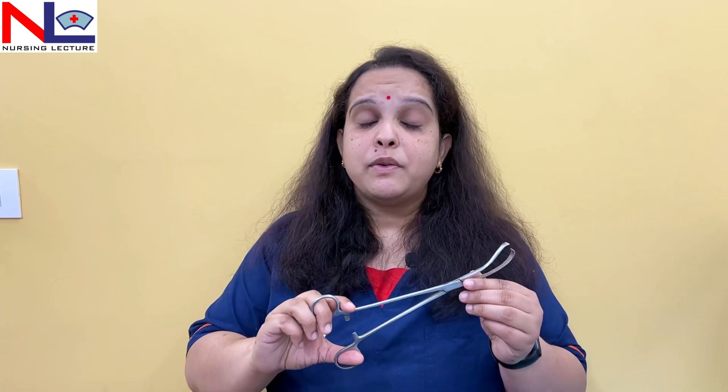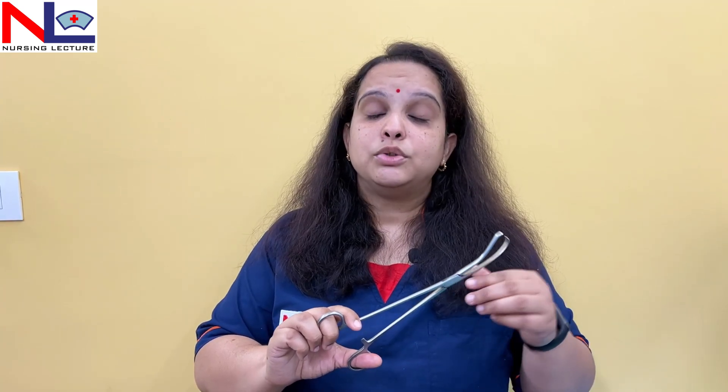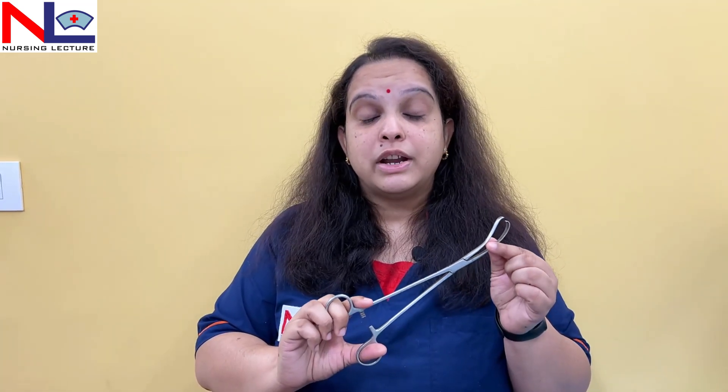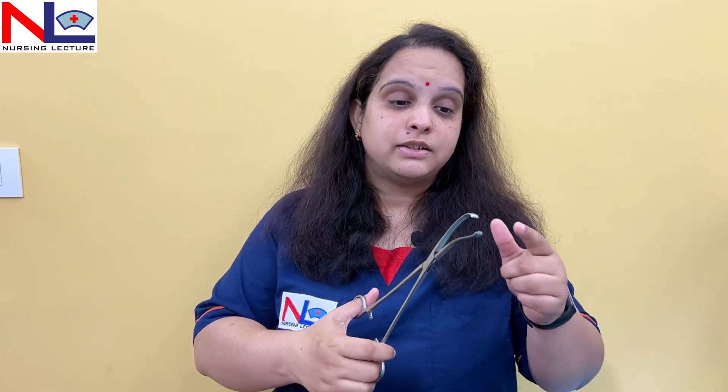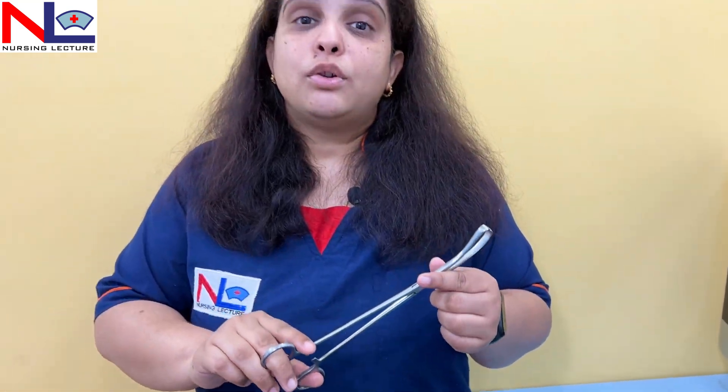Sometimes this instrument is used to lift up the posterior lip of the cervix as well — for example in culdocentesis, where we want to access the posterior fornix to collect fluid and blood accumulated in the pouch of Douglas. However, as mentioned, this instrument should never be used in a pregnant state as it causes heavy bleeding and pain due to its multiple teeth making it more traumatic in nature.